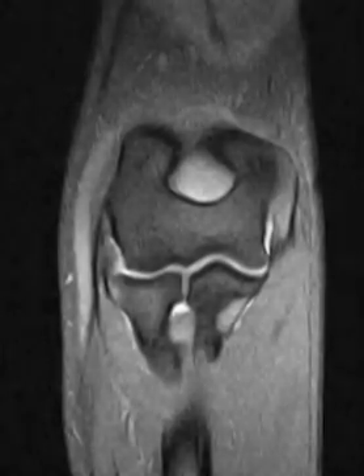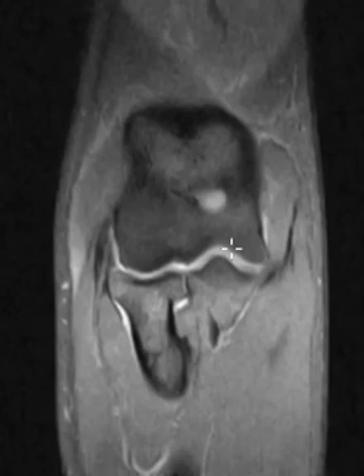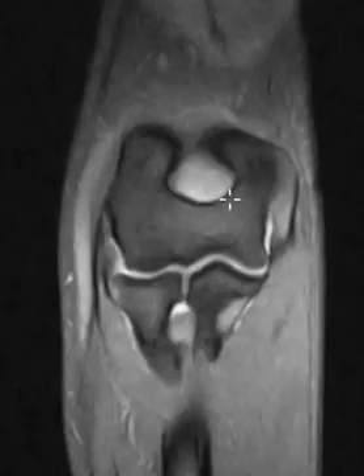They went to the ER and they said everything looked good on x-rays, but there was a lot of swelling, so they came in to get an MRI. Here we have a coronal view, and everything looks pretty good overall except for this big joint effusion.